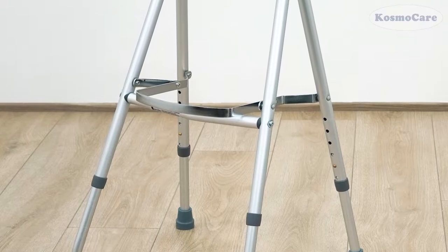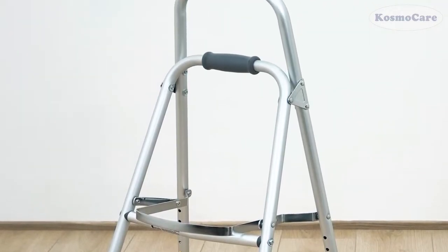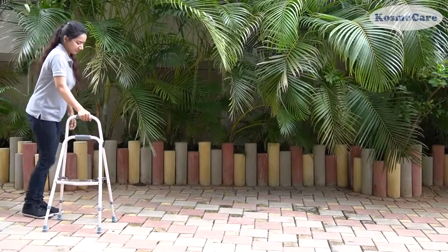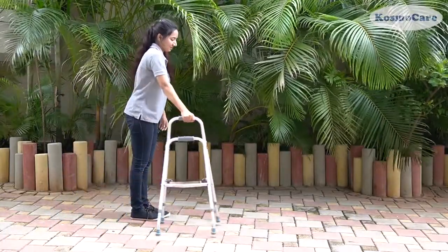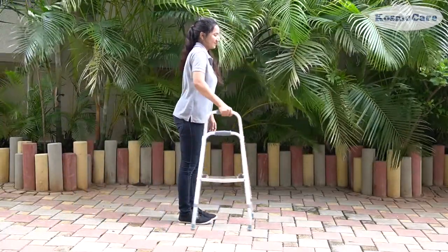The CosmoCare Hemi Walker is most commonly used by patients who have one weakened leg, such as seniors who have suffered partial or full paralysis of one side of their body, or any other medical condition that prevents them from accessing full motor functions in one leg.